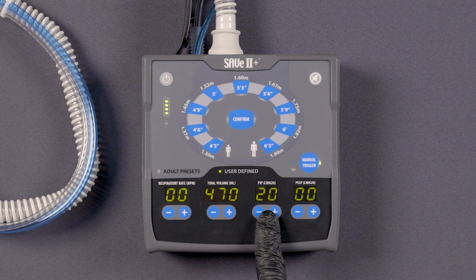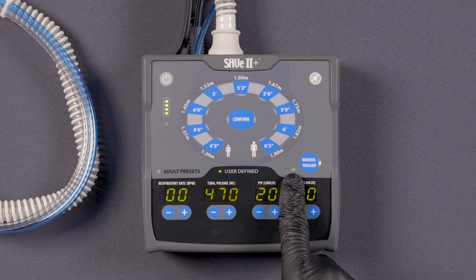Notice that the PIP has been automatically set to 20. Also notice that the compression rate indicator light is blinking, showing the rate of compressions.